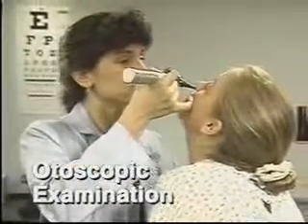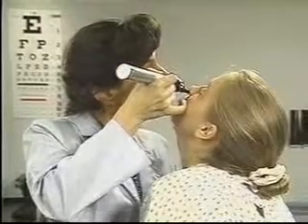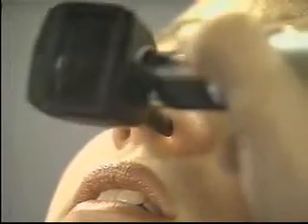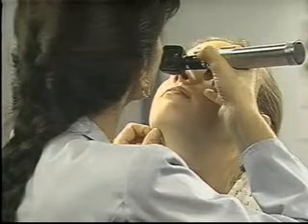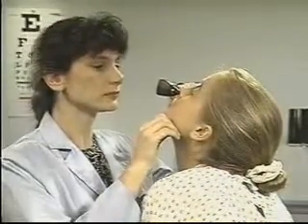To inspect the inside of the nose, use an otoscope with the largest ear speculum available. Be sure to insert the speculum carefully, avoiding contact with the sensitive nasal septum. Note the color and condition of the nasal mucosa that covers the nasal septum and turbinates. Normally, the nasal mucosa is redder than the oral mucosa and displays no swelling, exudates, or bleeding. Inspect the nasal septum for perforation or deviation. Look for any abnormalities, such as polyps or ulcers. Repeat this procedure on the opposite side of the nose.